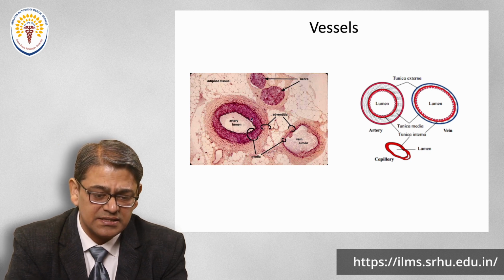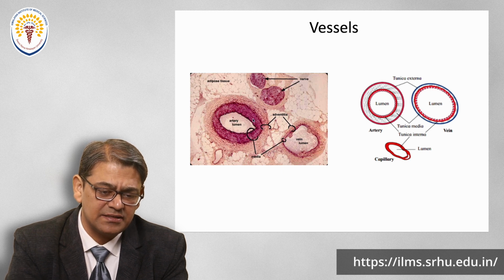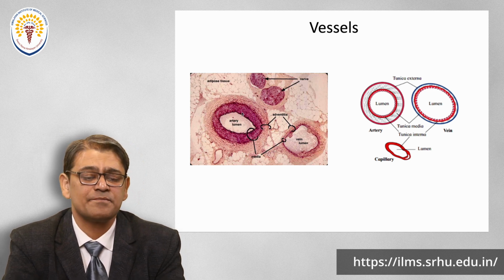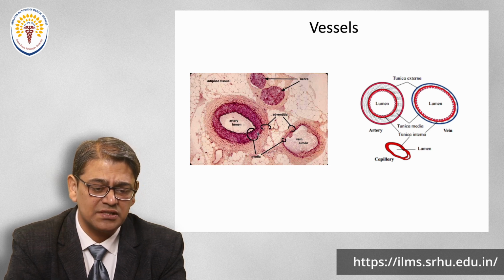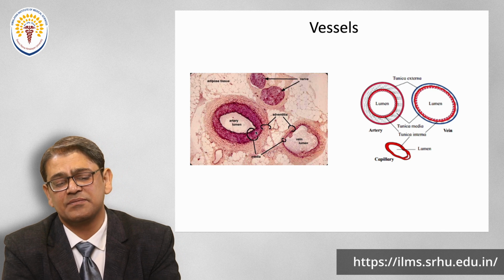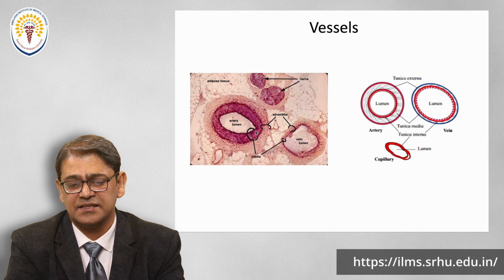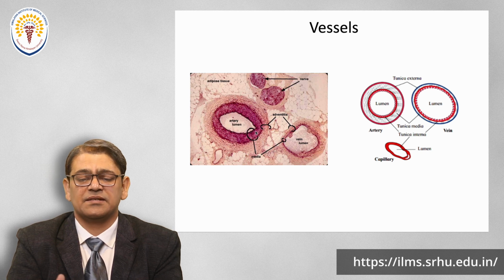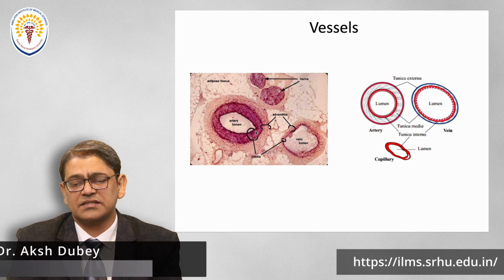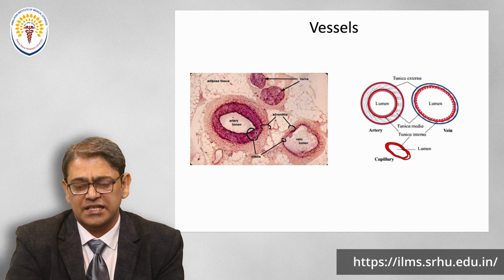Now if you focus on the tunica media here, we see that many pink colored wavy structures are present. It seems that this structure belongs to the elastic artery. If we see a homogeneous pink color more than these dots, then it is named more as a muscular artery, and then only can we see the internal elastic lamina. So from the histological point of view, not going into too much detail, this is the basic structure for beginners in histology: the difference between artery and vein thickness, and then the various sorts of arteries.